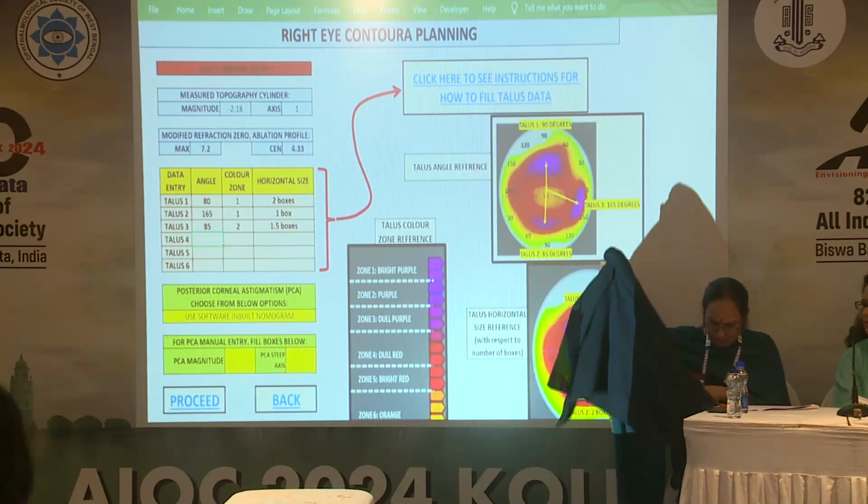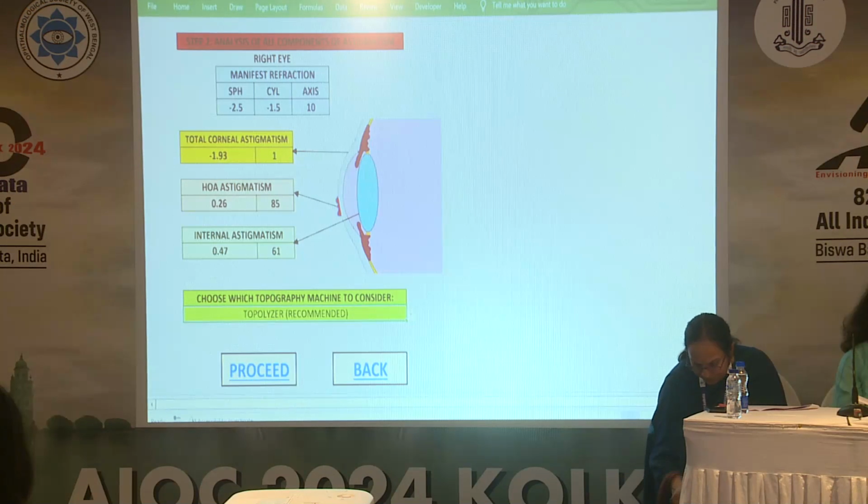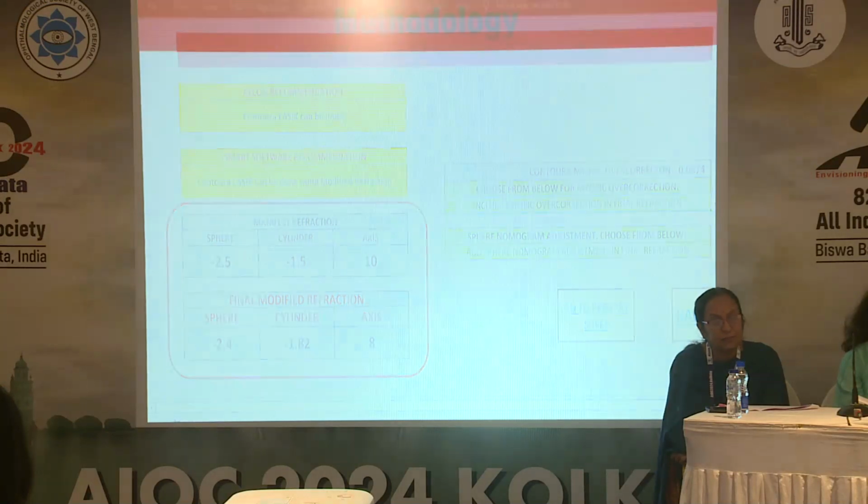This is how my software looks. Once you enter all the data, the software automatically gives you the astigmatism coming from all the individual components of the eye. Then it will tell you the final refraction that you have to feed into the machine in order to proceed.